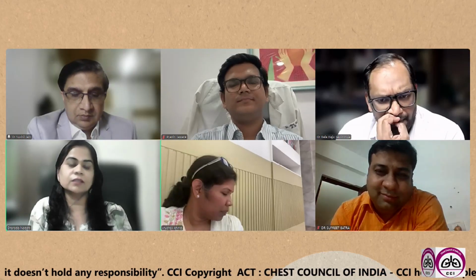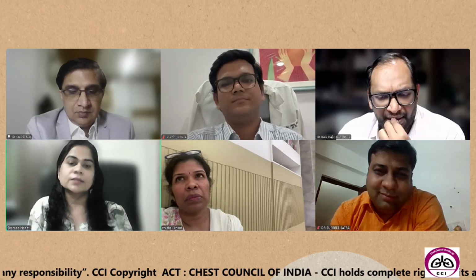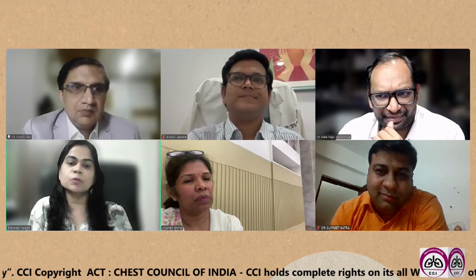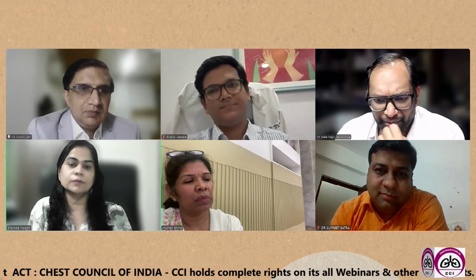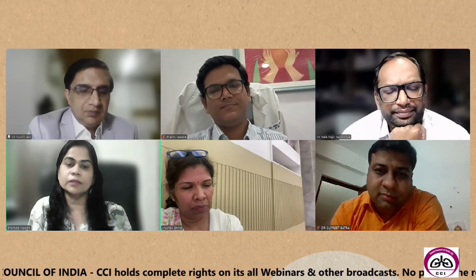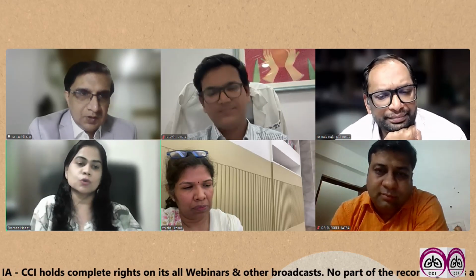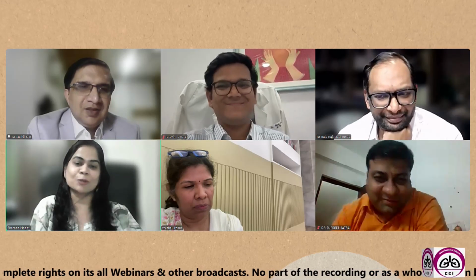And the final one is the test request form, which is sent along with the sample. The test request form should be completely filled. The site has to be mentioned, the indication for EBUS has to be mentioned, and along with that, the relevant clinical and imaging details also have to be mentioned. So these are the expectations of a pathologist from the pulmonologist.